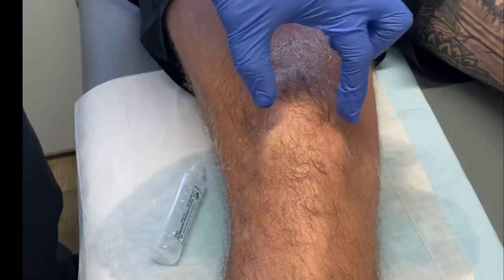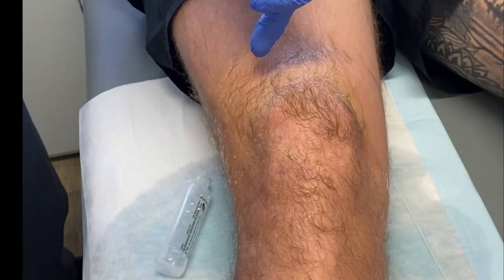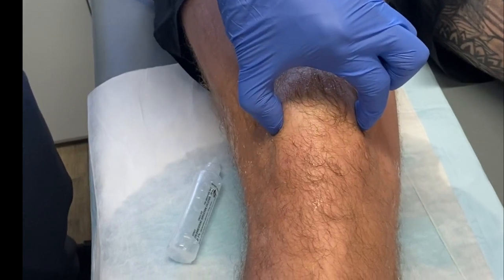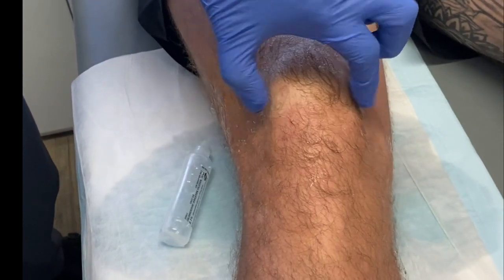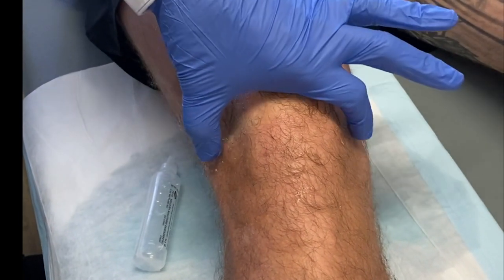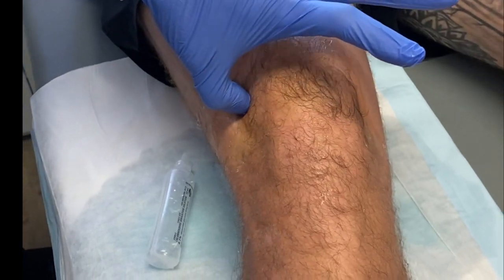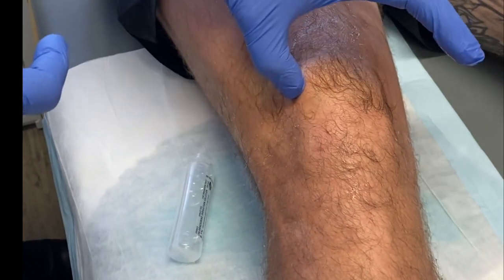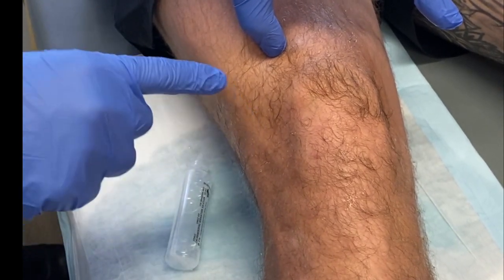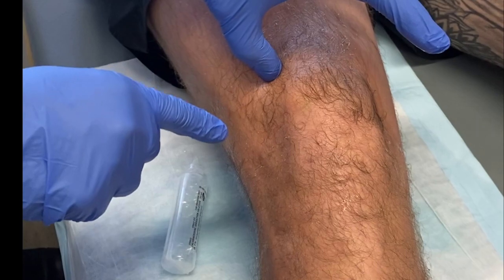Okay, surface anatomy: patella, patellar tendon, tibial tuberosity, quadricep tendon. It's got a bit of muscle wasting, but that's beside the point. Here's the patella — behind the patella lie the femoral condyles, the epicondylar area. In here is the suprapatellar pouch. The quadricep tendon runs here, the femur bone runs here, and there's a gap in between the quadricep tendon and the femur.